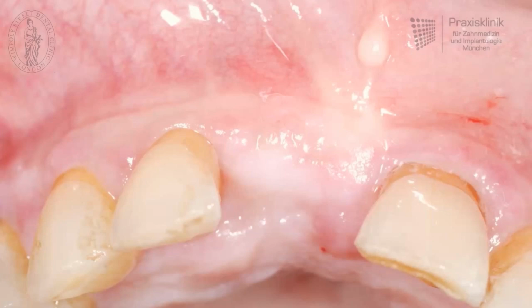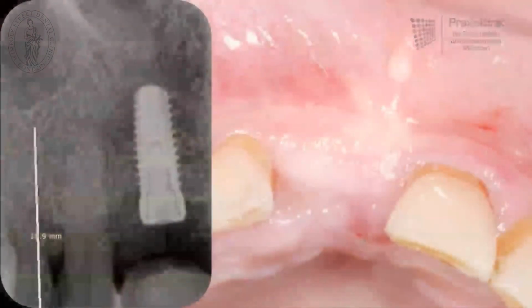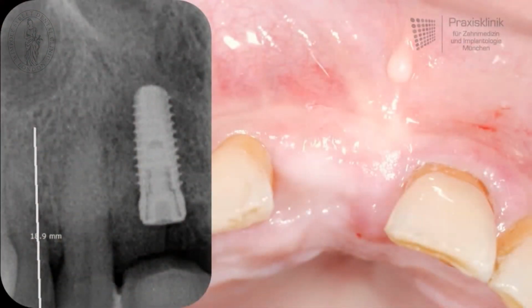After a 3 month healing period, when we take a look at this picture, it is hard to imagine that there has been a bony defect of this size and geometry as we have seen before. Now everything is prepared for having an implant. As we can see in the X-ray image, the implant is placed in a good position. Now we have to wait for another 3 months, and after that the implant can be uncovered.